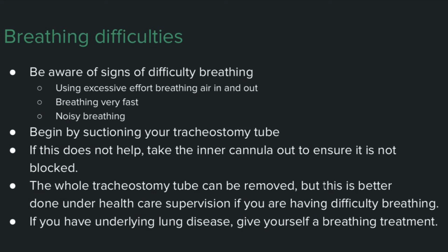For patients with COPD or asthma, a breathing treatment can be administered through the tracheostomy tube, typically with a nebulizer.